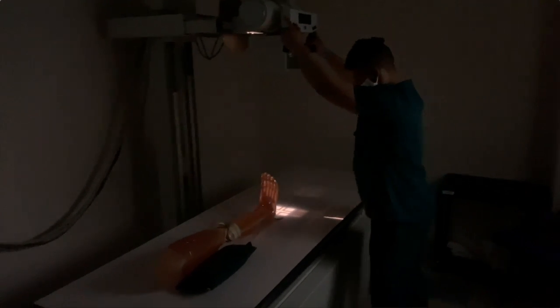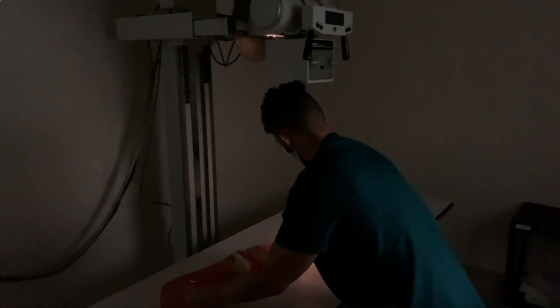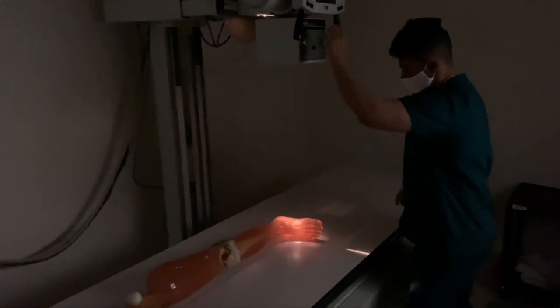For the lateral mediolateral projection, the technical factors are the same, but the patient will be in a lateral recumbent position with the affected side down and flexing the knee 45 degrees. As you align the CR with the IR, make sure the CR is perpendicular to the IR, about 1 inch inferior to the medial malleolus.